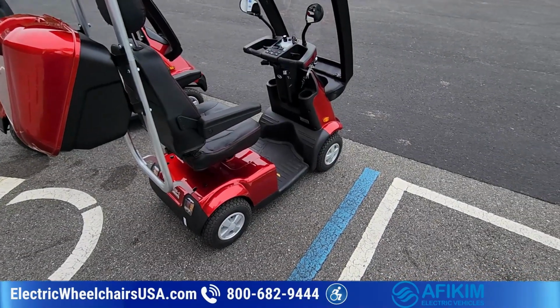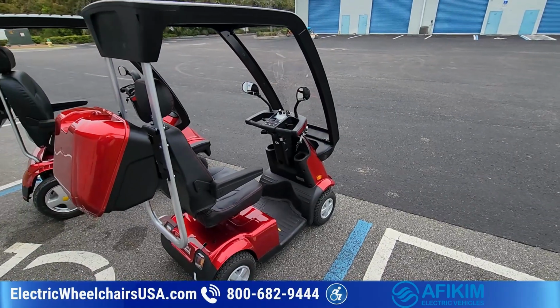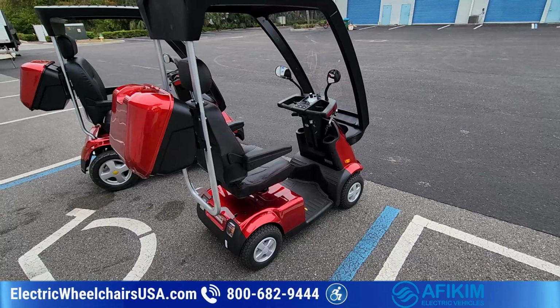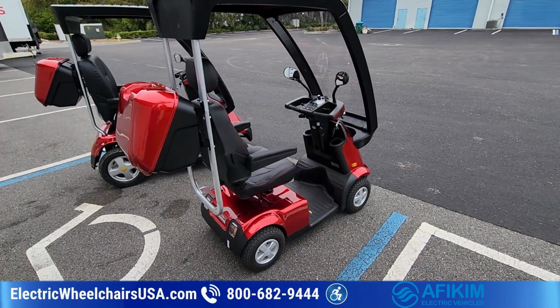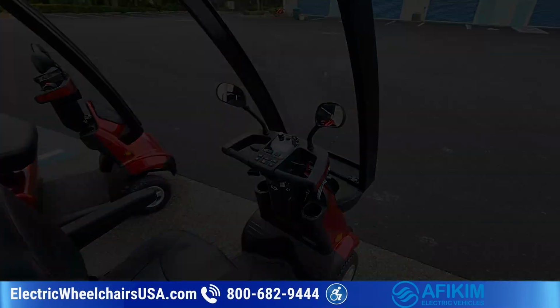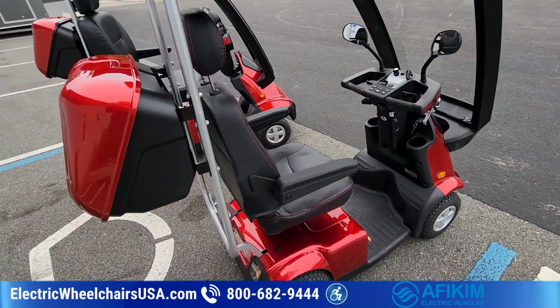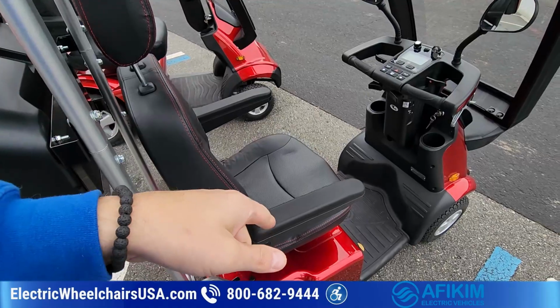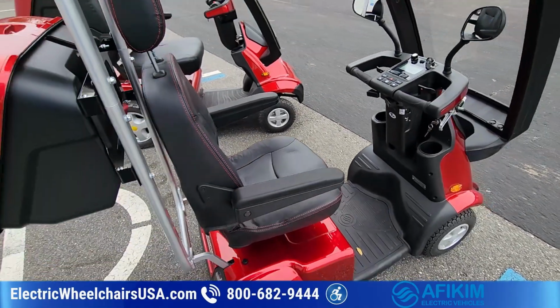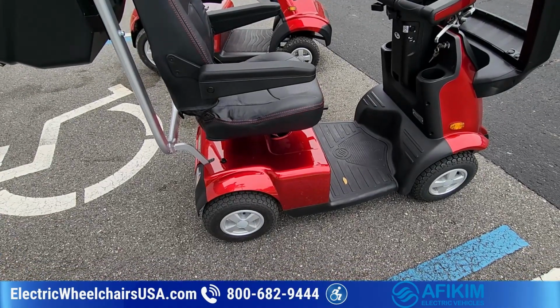So a lot of these Afikim scooters will last a long time if you take care of them. And having good batteries and being good about charging your batteries often is really important. So if you live in a cold weather environment, or it's the winter, it's probably a good idea to remove your batteries. So you have to actually take the seat off, and I'll show you where they're at, just so you can see.